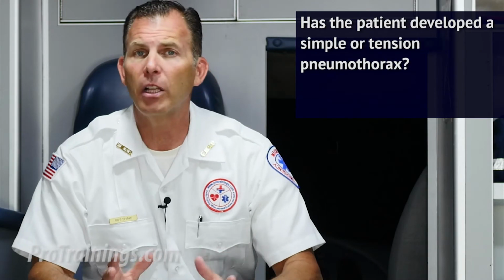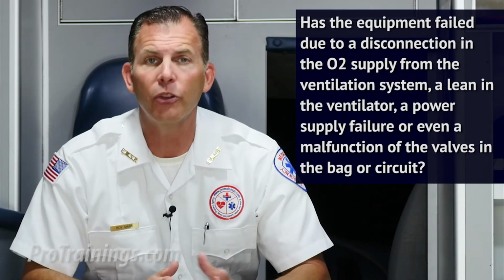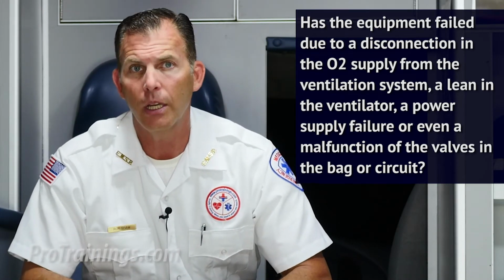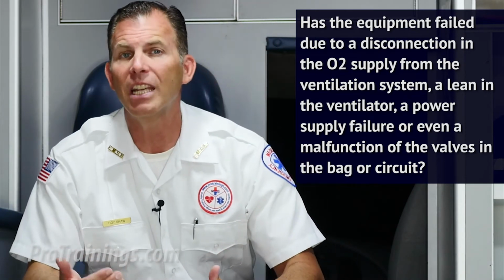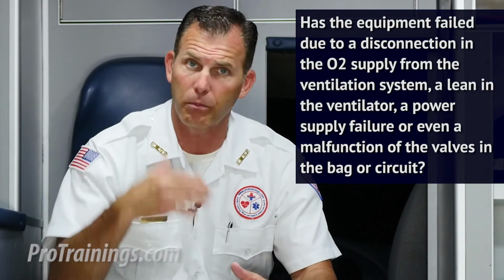Has the patient developed a simple or tension pneumothorax? Or has the equipment failed due to a disconnection in the O2 supply from the ventilation system? A leak in the ventilator, a power supply failure, or even a malfunction of the valves in the bag or circuit can all cause this kind of failure. So if there is a mechanical failure, we must remember to go back to the basics and even begin to manually ventilate the patient with a bag valve mask if the patient is on a ventilator.